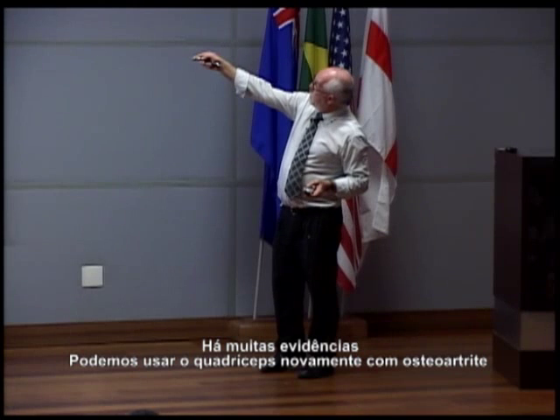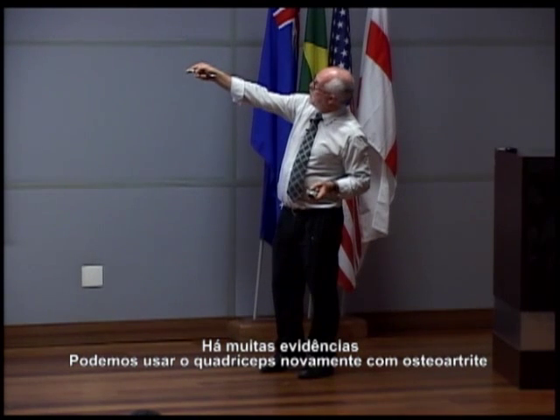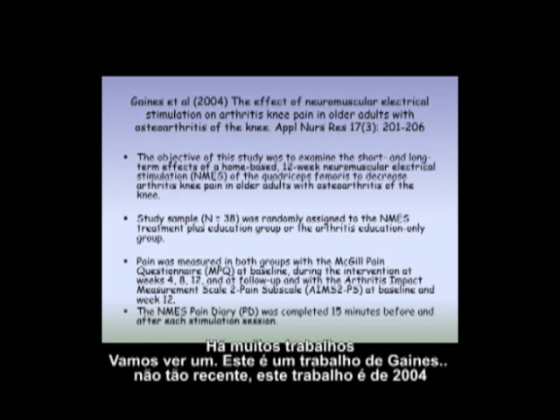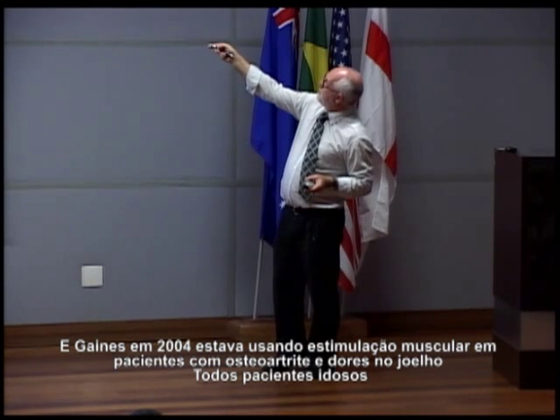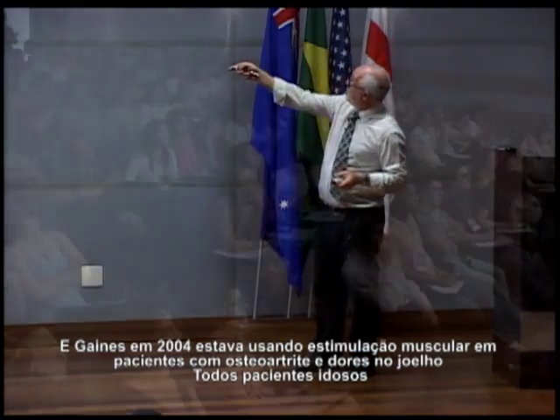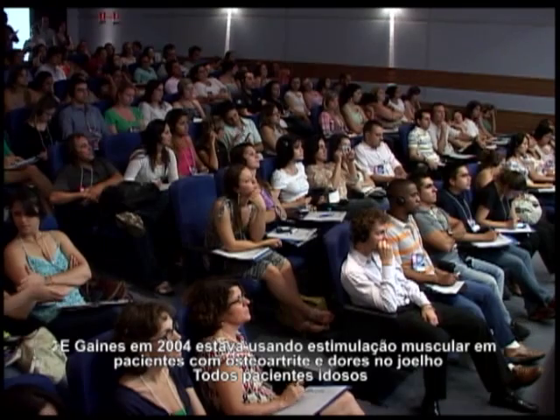So we can use quadriceps again with OA knee, electrical stim, osteoarthritis, etc. There's lots of papers. We'll look at one. This is a paper by Gaines.